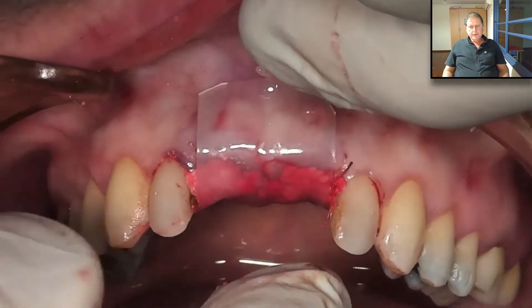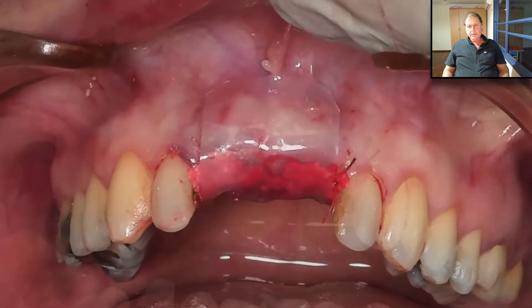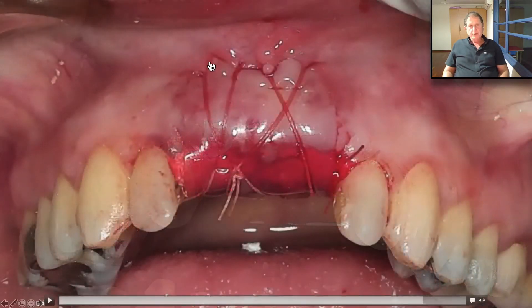Now, the only thing we do is take the Oraid and protect the area — simple as that. It sticks to the mucosa very nicely; it stays and does not move. We need to secure it so it will not fall after a few hours, so we perform some sutures. We go from the mesial side to the distal, on top of the Oraid, to the palatal side, to the mesial, going into the soft tissue to the distal, coming back to the mesial, making our first knot. We did two cross sutures like this, and now we can be sure the Oraid will protect our wound.